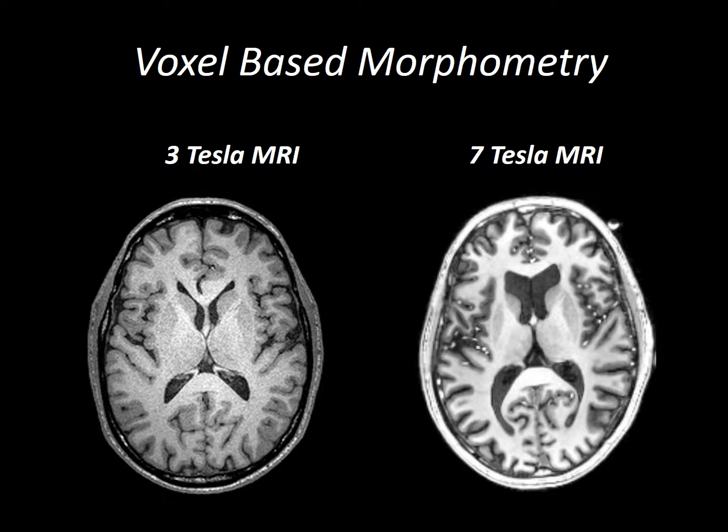One of the biggest advances in brain imaging analysis techniques over the past 15 years would be the invention of brain morphometry. Now, morphometry is the study of the size and shape of the brain and its structures, and is one of the most used modalities and analysis techniques in brain imaging. There are multiple techniques used to explore brain anatomy using these T1 weighted anatomical images. The two most common are grey matter volume calculations using a technique called voxel-based morphometry, and the second is the measurement of regional cortical thickness.